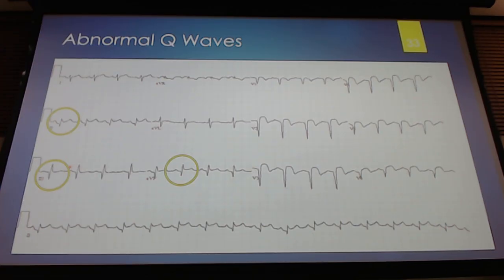That might indicate. The other thing I want to see, because we haven't talked a tremendous amount about this yet, but you should still be able to recognize it. We talked about the ST segment, and we said that the ST segment should be along the baseline, right? Should be along with our PR segment. What do you guys think about the ST segment in a couple of these? Okay, so let's just look here. I mean, we can even look here. Well, here's our P wave. Our PR segment's down here, so either that PR segment is really depressed, or this is elevated.